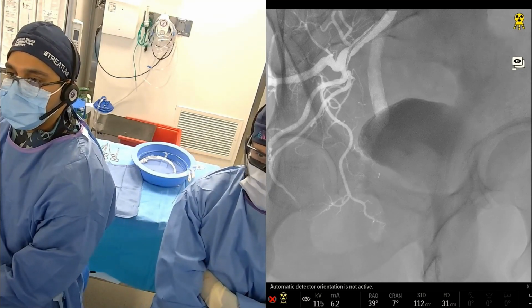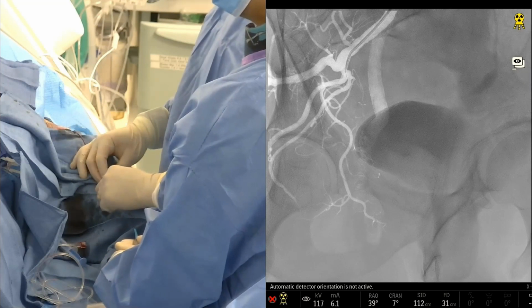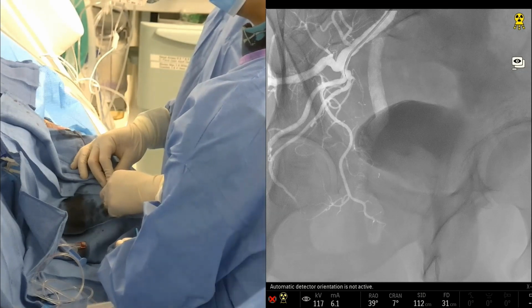The sniper obviously tracks really well, as we saw in the other case with a type 5. But I think you have to consider the curve on this, so type 1s can probably be the most challenging to get into. I can't anticipate there's going to be a problem working here with the True Select, or are you with a sniper right now?